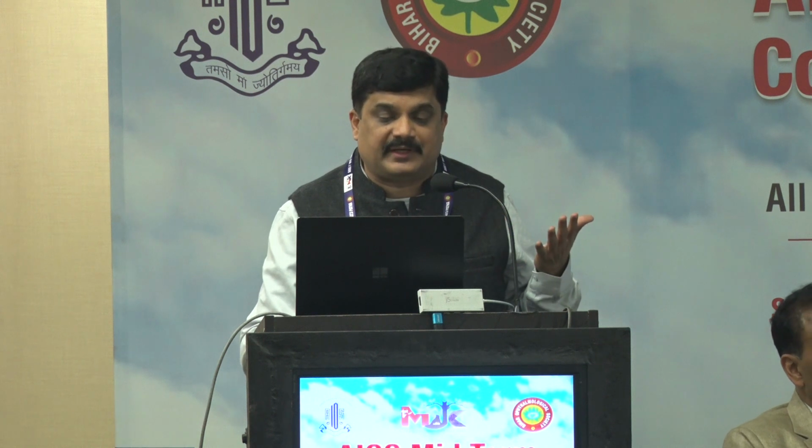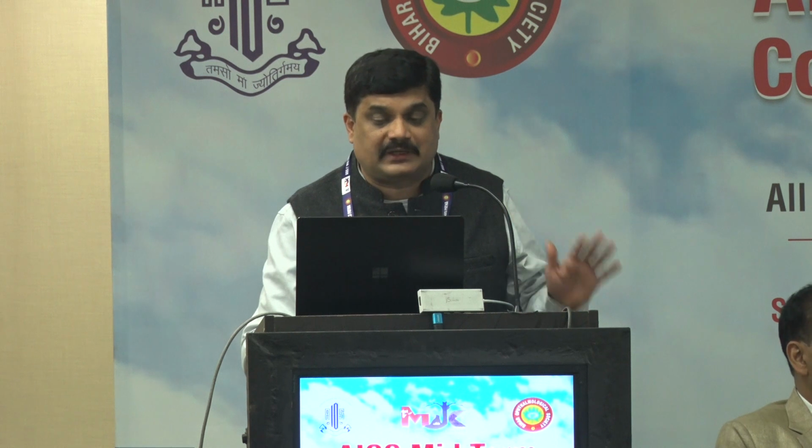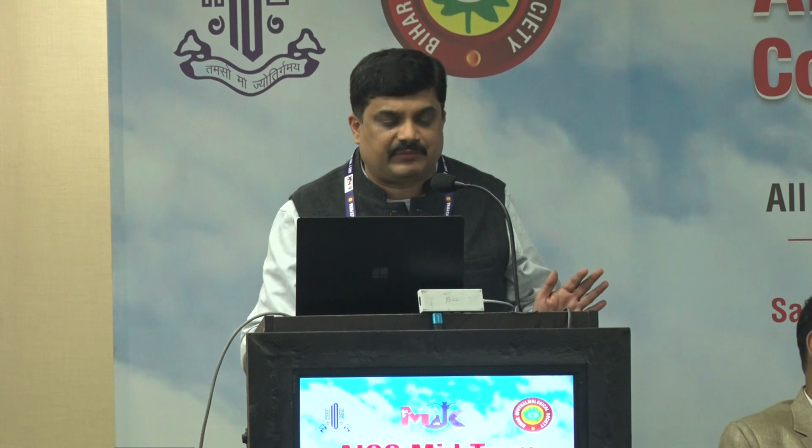Basically, biometry consists of keratometry reading and the axial length of the eye. So if you go to any of the literature, claims relating to biometric error or wrong IOL power were almost the second most frequent cause of claims and result in payment damage of almost 62% of the closed cases. So coming to the keratometry, basically it is used to measure the corneal curvature. We have to do it before axial length measurement.